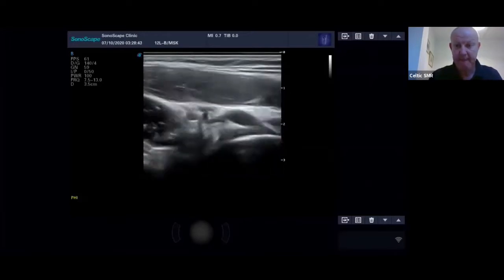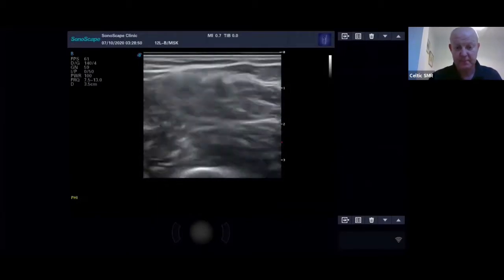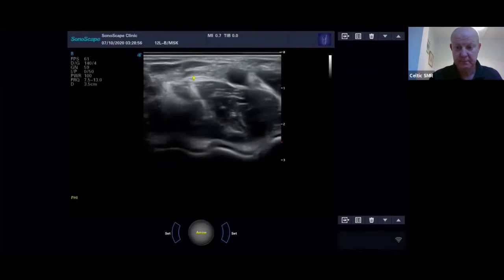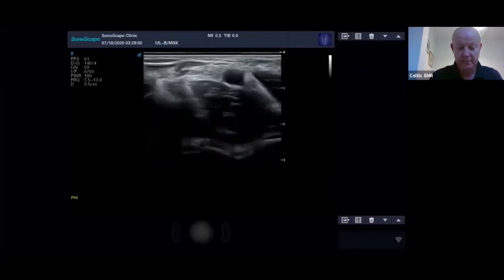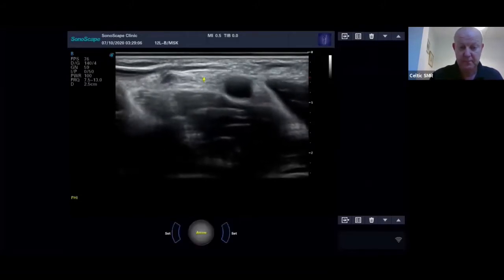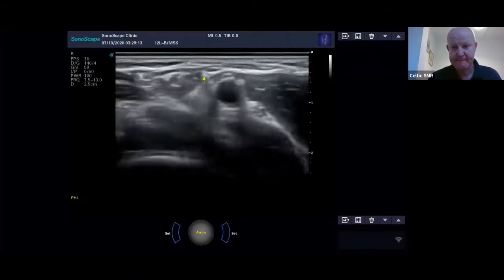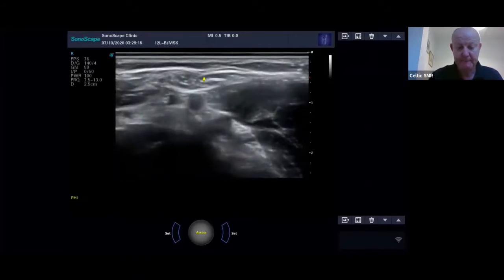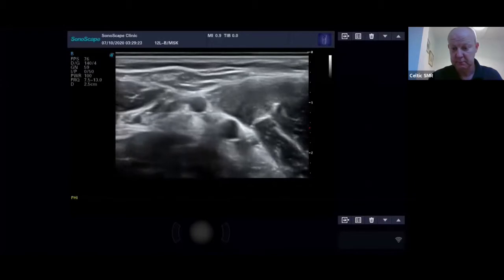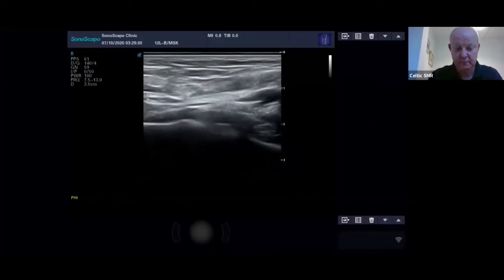So we scan from medial to lateral then? Yeah, I mean you can follow it down. Let me get the arrow. So this is the tendon. I've got my focus. This is it. There's the biceps tendon here. Okay. And I'm going to follow it down, and then it dives. So you've got to keep adjusting, so move your focus down. Now move my depth up, so I need a bit more real estate. And then you can turn on it, long section.